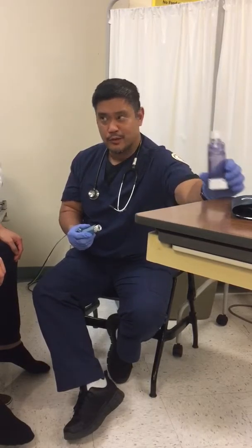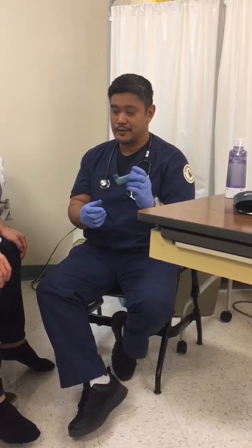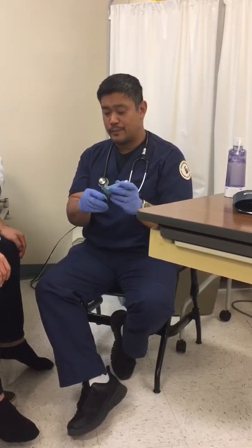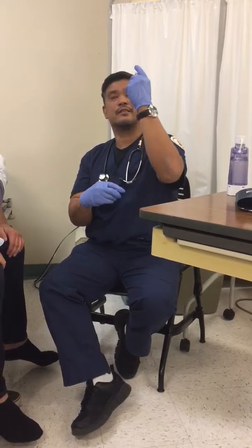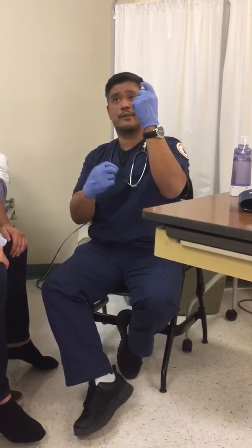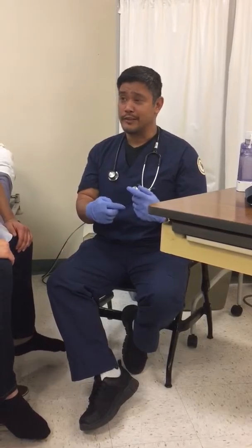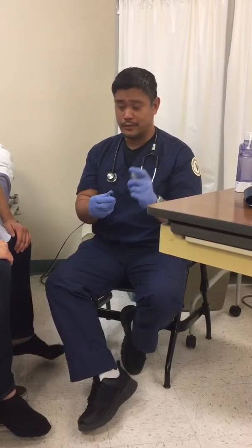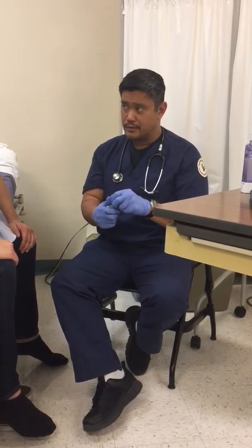Ideally, it would be a good idea to use a spacer, but if you don't have it, just use the device itself. You can wrap your lip around this, again exhale out completely, tilt your head a little bit for better action, and when you press down, go ahead and breathe in along with it. It's better with the spacer to get more of the medication down to where it needs to go, but if you need to, you can do that, and it's a really good idea to have this with you. All right, do you have any questions?